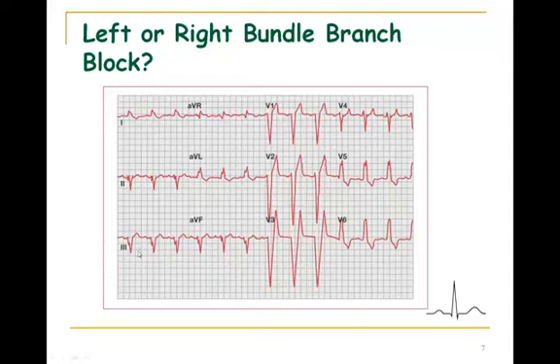But a good way to really back up whether it is left or right is to look at your chest leads, V1, V2, 3, 4, 5, and 6. The chest leads, remember, are right over various regions of the heart. It amplifies the problem. If you look at V5 and V6, you notice those bunny ears standing right out at you.